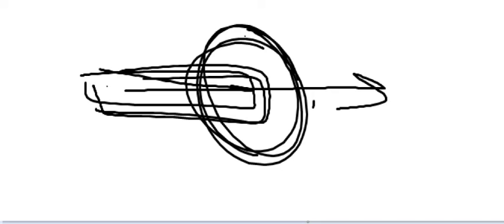But the time is more, so artifacts will be more: beating heart motion will be more, breathing motion will be more, but the image will be better. Radiation will be more. If the table moves slower, radiation will be more because the exposure time is more. Got the idea? If the table moves faster, the heart beating motion will be less, breathing will be less, radiation will be less, but the image is less good because it's fast.